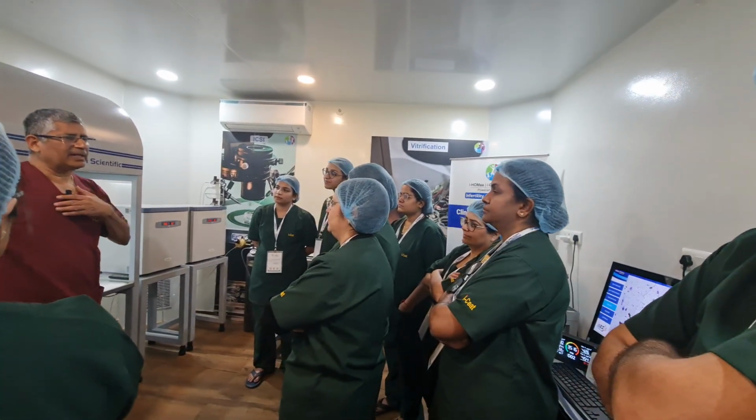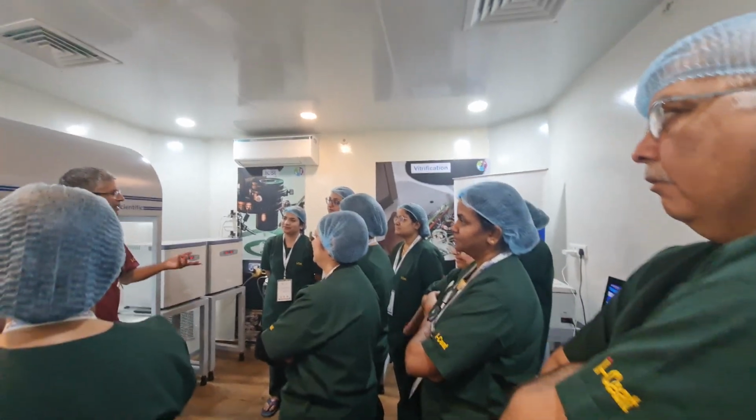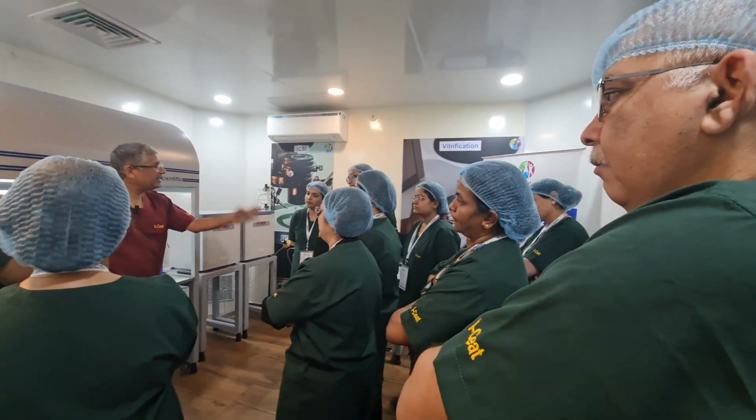But once we stabilize at our body weight and age, you know that nothing worse can happen to us. So our clothes become XL and XXL. So in the lab, whatever you do should be fixed for a minimum of 8 years.